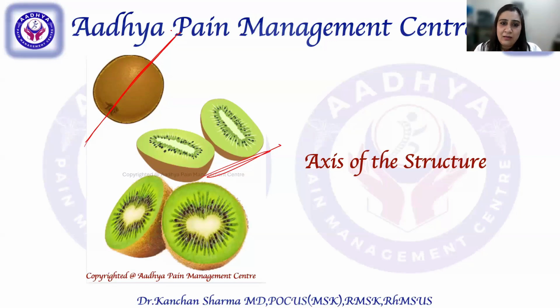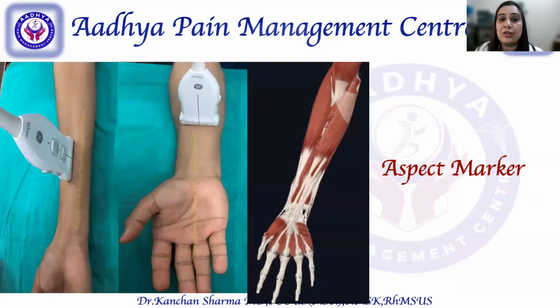Now it depends on me where I want to cut this kiwi. Do I want to cut it here, here, here, here, here? It depends on me, right? So that is what your longitudinal axis or the sagittal section is in ultrasound. I'll be showing you in the demonstration, but before that, just have a look.